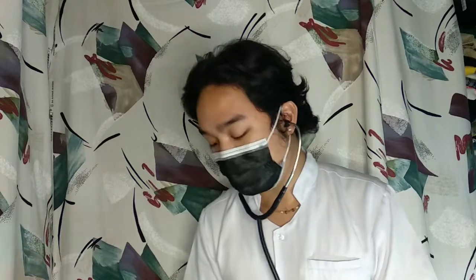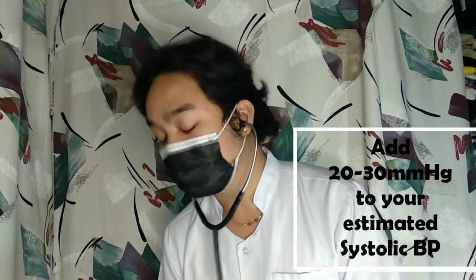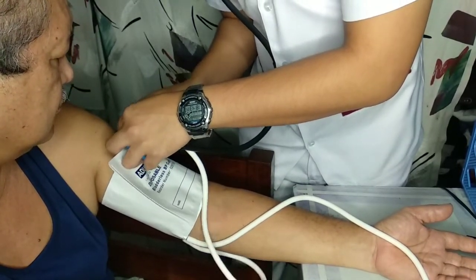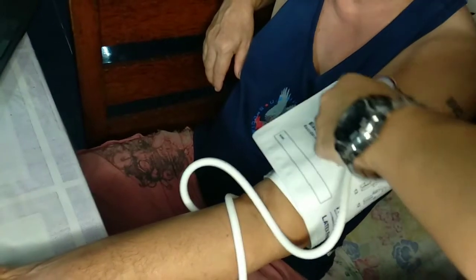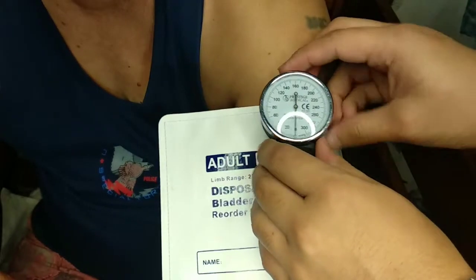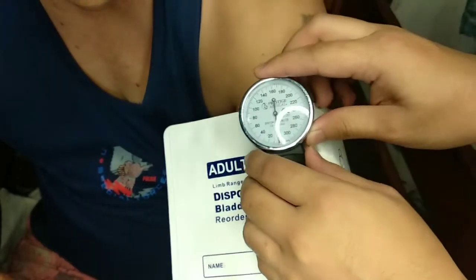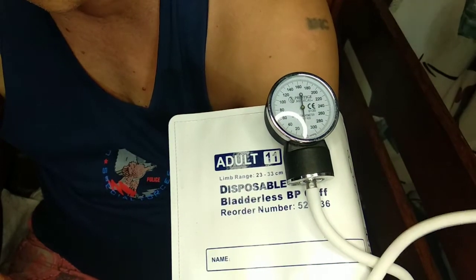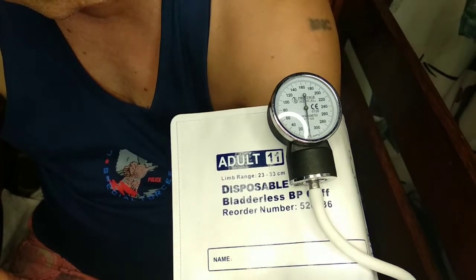After you properly position your stethoscope over the brachial artery, you need to reinflate the cuff. So reinflate the cuff with an additional 20 to 30 mmHg above your approximated systolic blood pressure.